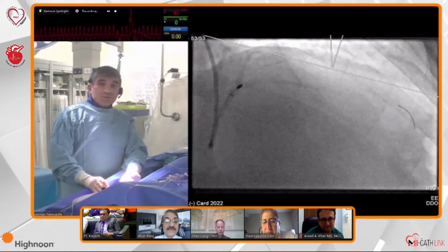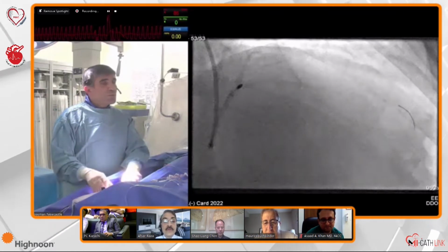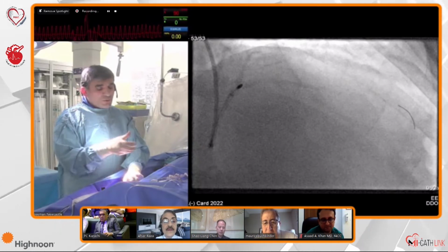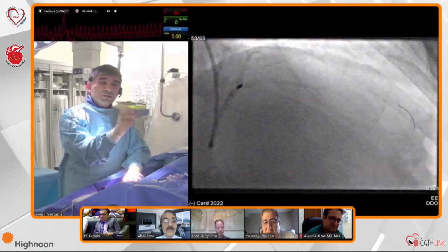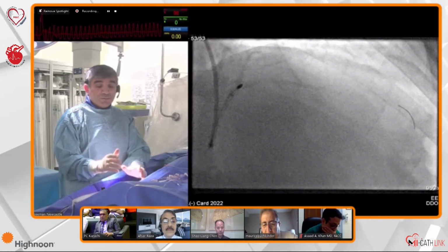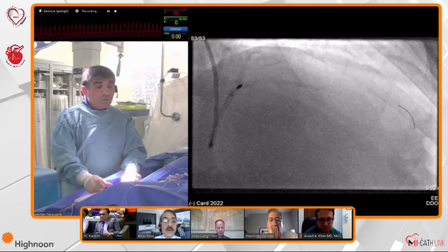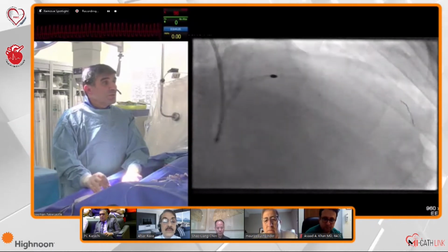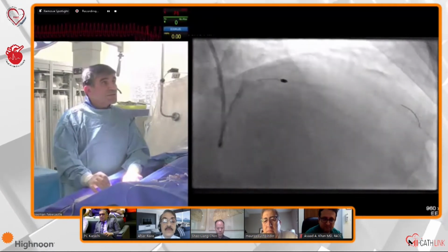Okay, so this is very interesting. I recently reviewed a paper on this. There could be a true drop in the blood pressure, but often what you find is your blood pressure is okay. The minute you inject the dye, because of the shaft of the rotablation, because of all that's happening, the pressure gets blunted and low. You just really have to be aware of this. You could flush the catheter and the pressure will change. But if it is a true drop in the blood pressure, then it's usually no flow or really a vasovagal reaction. So you have to be wary of that. But quite often, this happened here. The minute you inject dye, you find the pressure wave has changed.